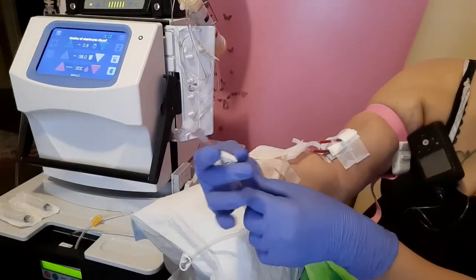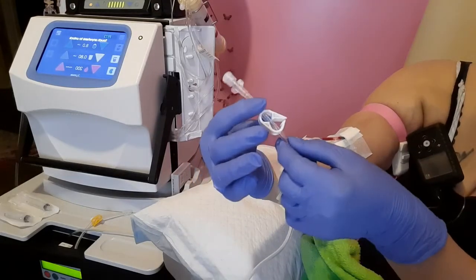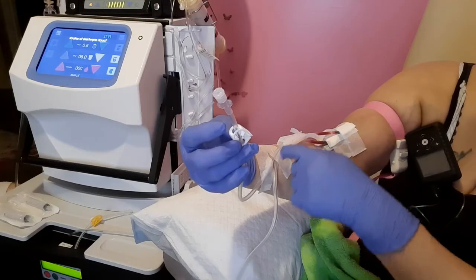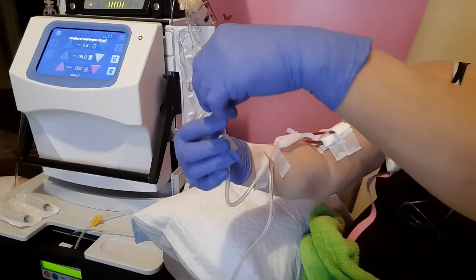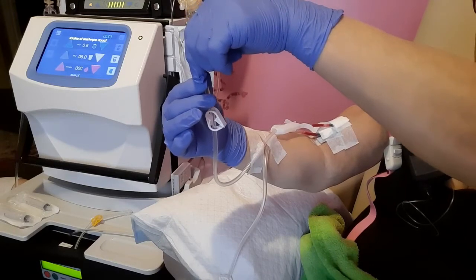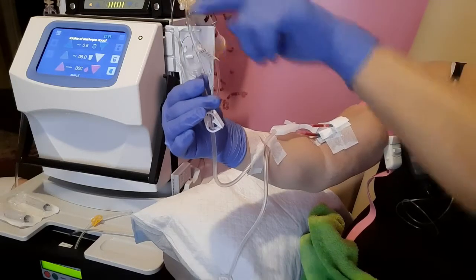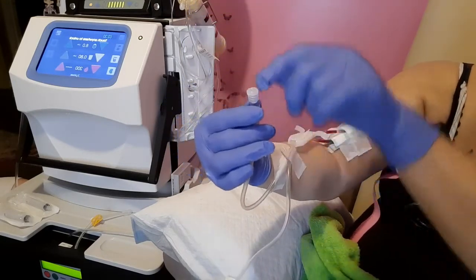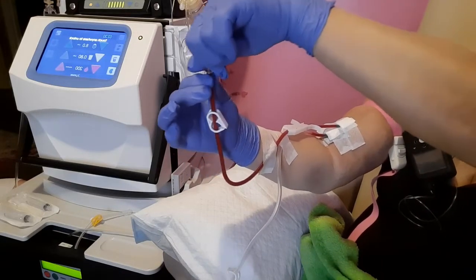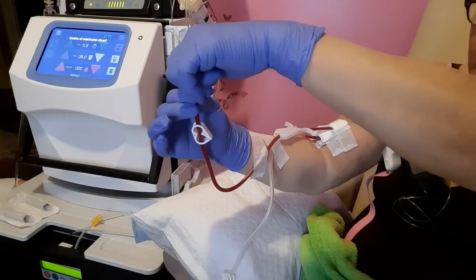All right, so now, here's what we do. See that clamp is open? We're going to leave it open. Why? Because we want to bleed back the blood to see, check the flow of the venous. So always do the venous first. So we're going to loosen the cap on the top, and we're going to let the blood flow. That's a good flow. That means we're in there good.